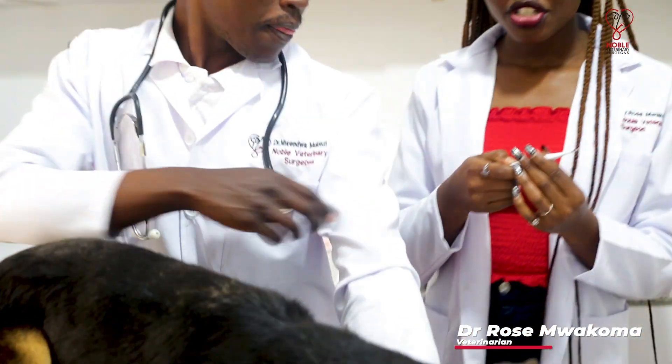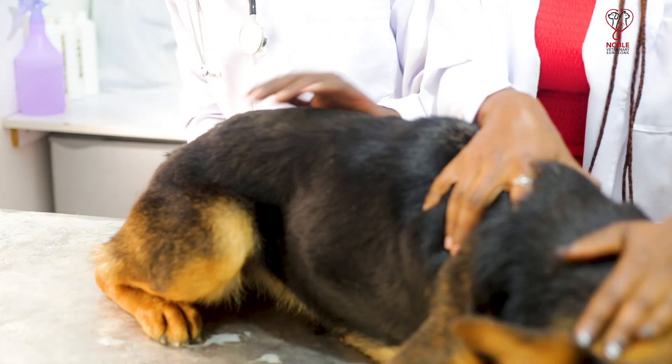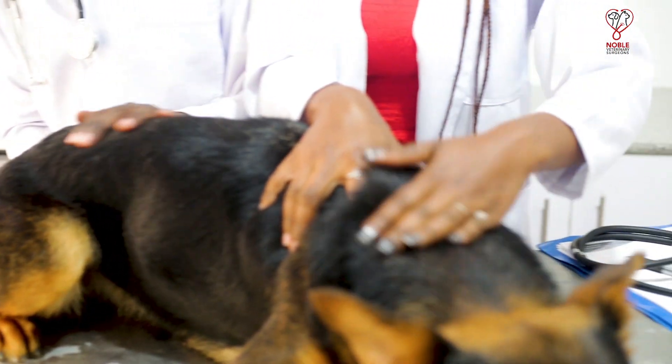The final vital parameter we take is the temperature. The temperature in an animal is usually taken at the rectum. The normal temperature for dogs ranges between 38.3 to 39.2 degrees. The temperature is very important as it aids in checking whether the animal is unwell.